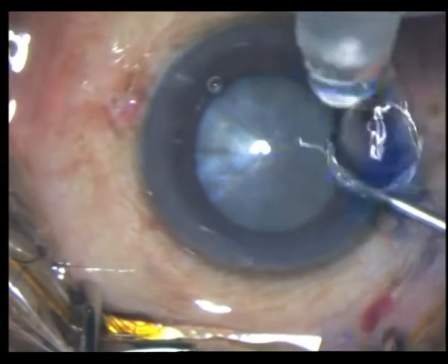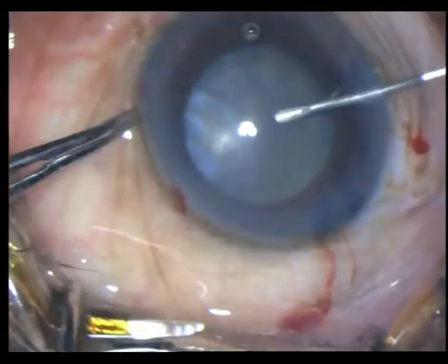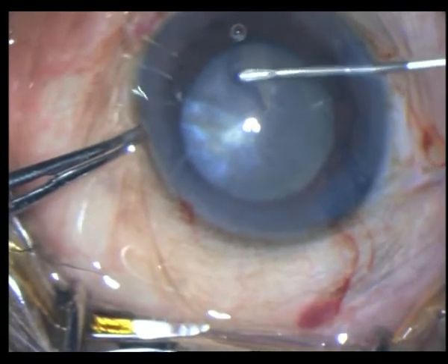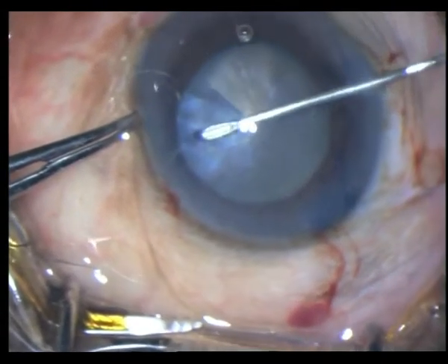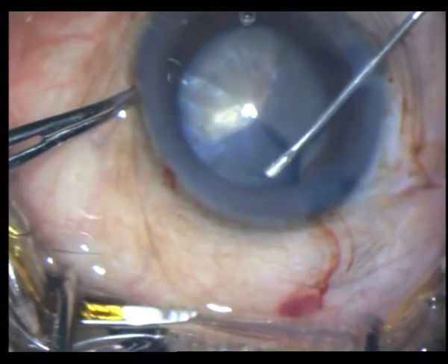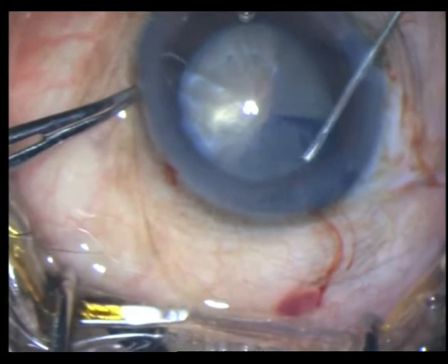I then take a bent 26 gauge needle and fashion my capsulorhexis. This is going to be almost a 5.5 mm capsulorhexis, or even slightly larger.